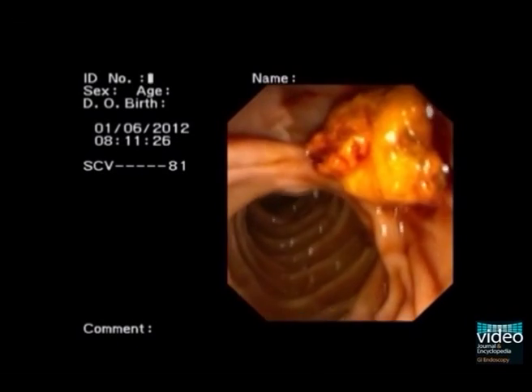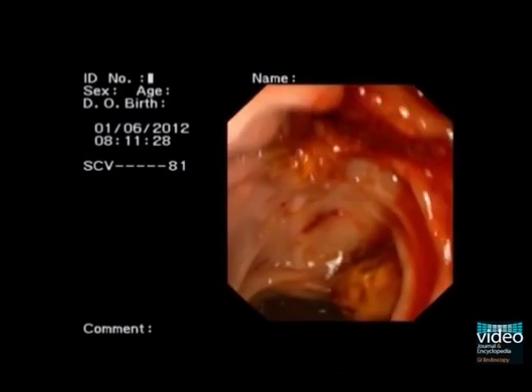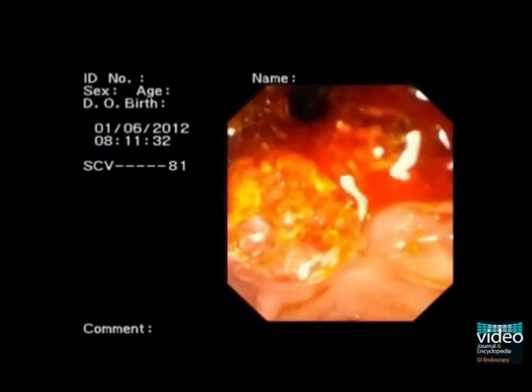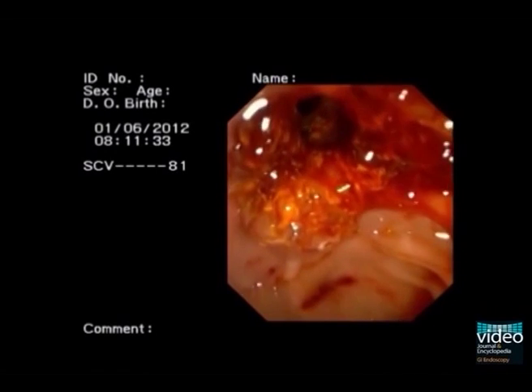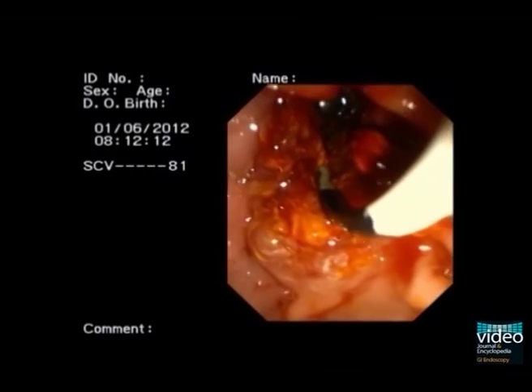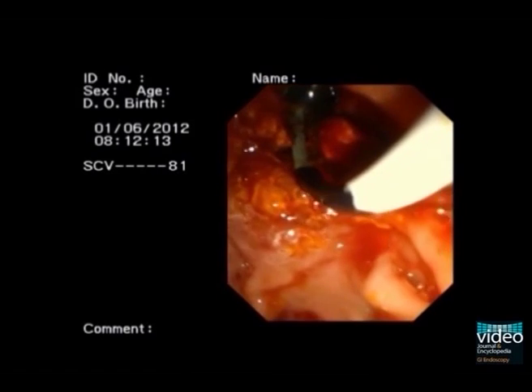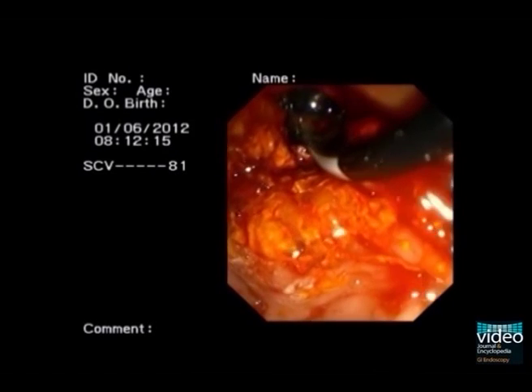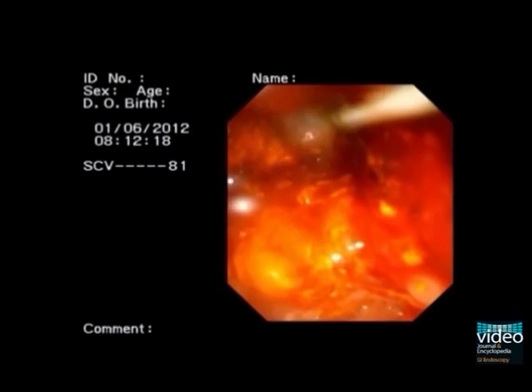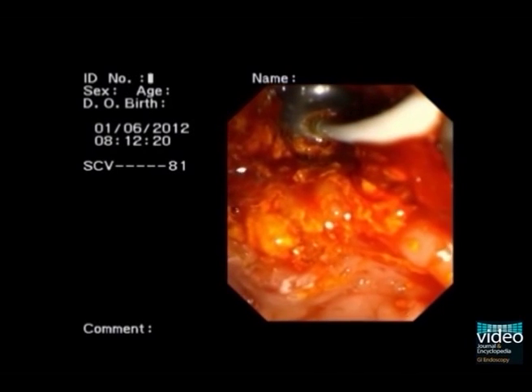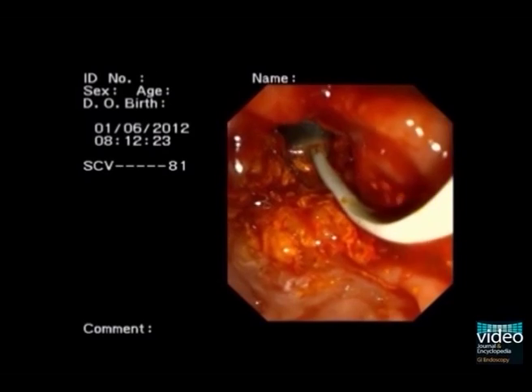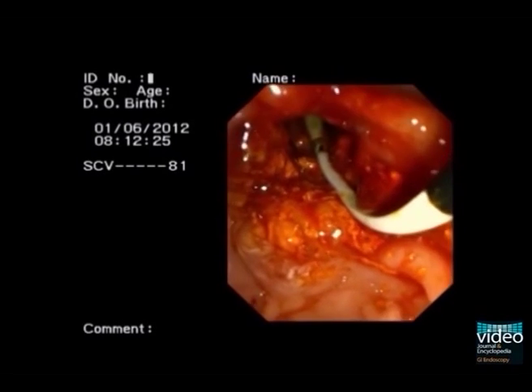The CBD is completely cleared. Occlusion cholangiogram using the extraction balloon, which can be seen endoscopically. Final passage of the basket without stone extraction confirms clearance.